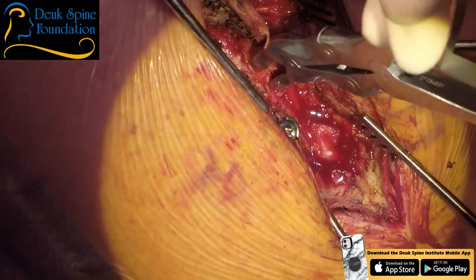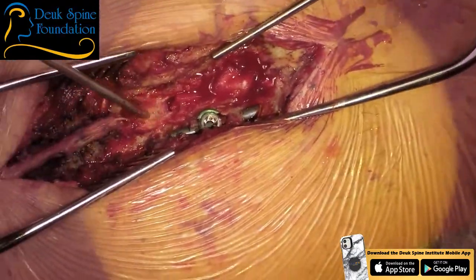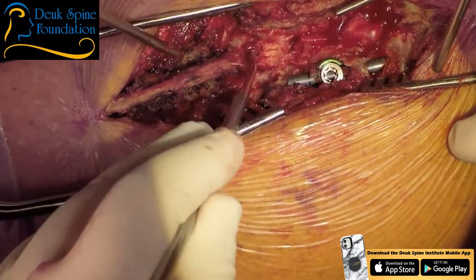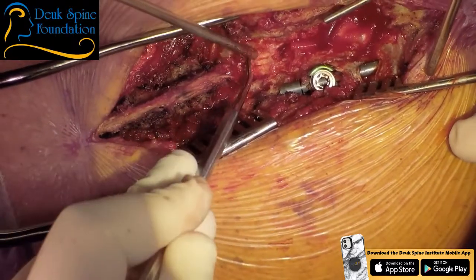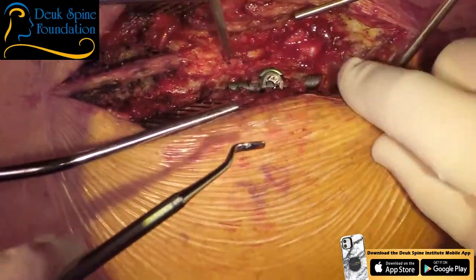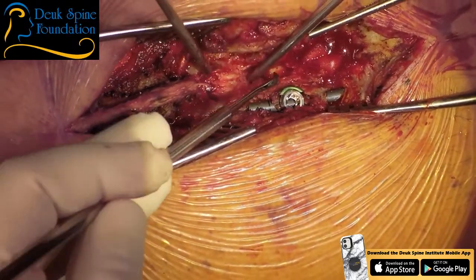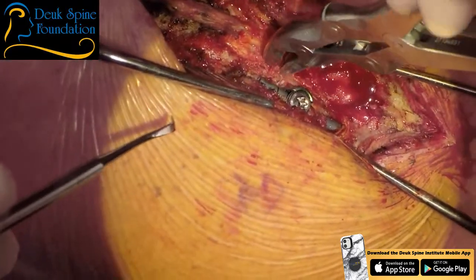This is all ligamentum flavum. That's just hypertrophy. Let me have a Woody. So there's a little bit of epidural fat here where Patel is sucking. But what I really need, I need you to suck while I work so I can see. All right, probably the best thing is gonna be to come from bottom to top. So let's get that out. Large bite. This is just some scar tissue we don't need, it's just getting in the way.